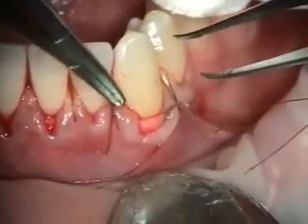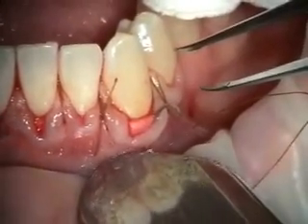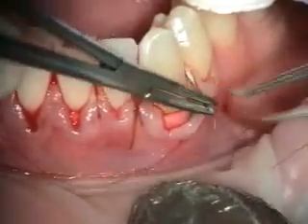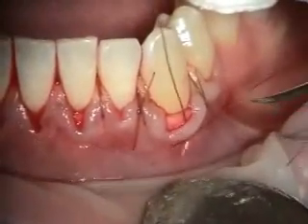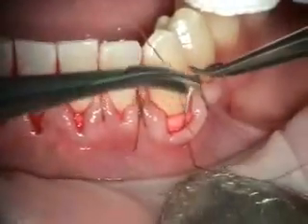We've done interproximal sling sutures, and because we've got another piece of graft coming in here, I'm going to do these next. Now we're going to suture the gingival margin coronally.